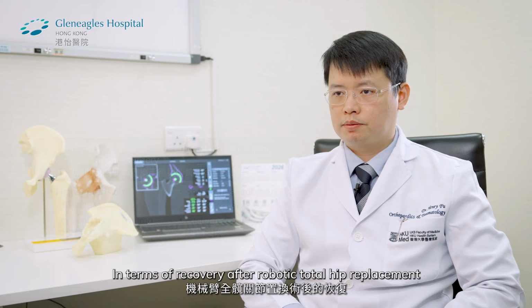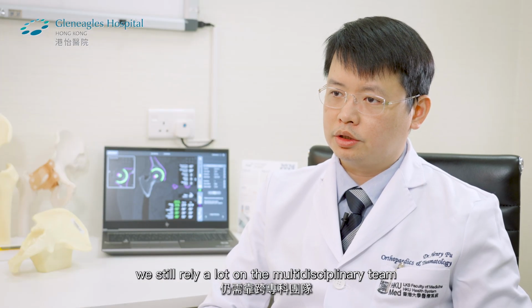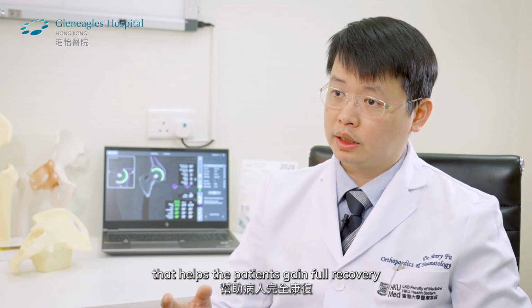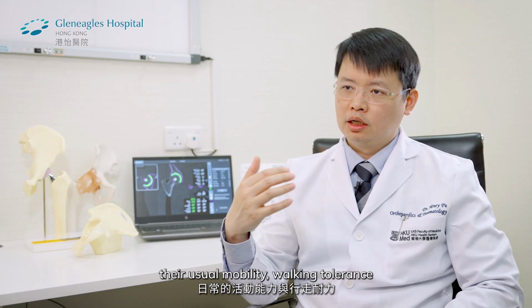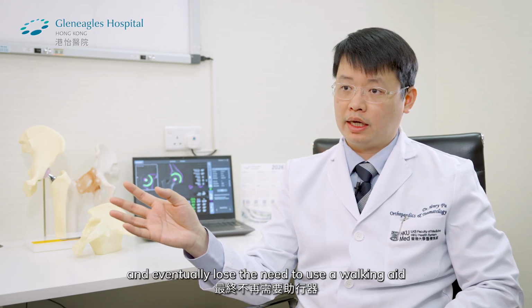In terms of recovery after robotic total hip replacement, we still rely a lot on the multidisciplinary team that helps the patients gain full recovery. The physical therapists would attend the patients either the same day or the next day. We aim to train the patients' muscle power, range of motion, and allow them to gain back their usual mobility, walking tolerance, and eventually lose the need to use a walking aid and at the end return to the sports activities that they are keen to perform.